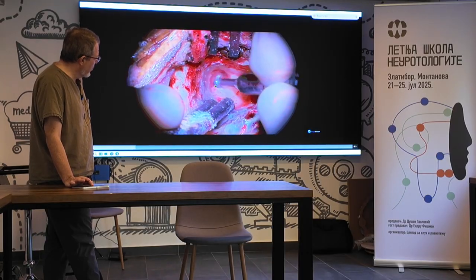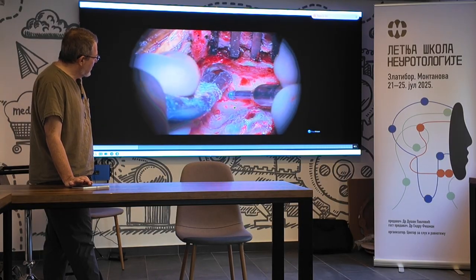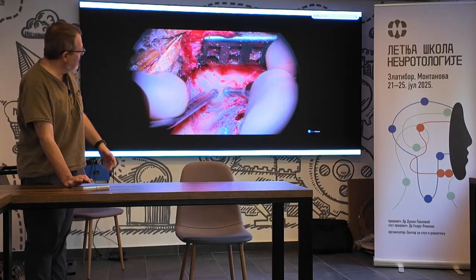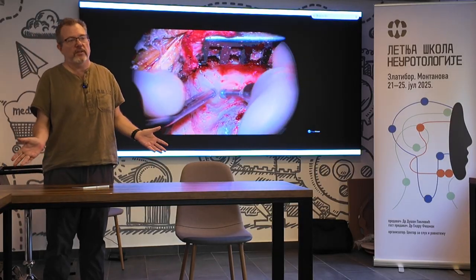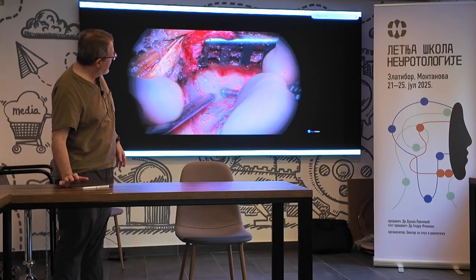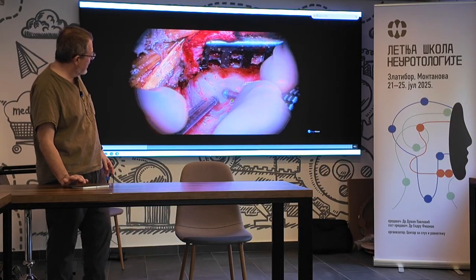And now I'm going to do a labyrinthectomy. So it begins with a labyrinthectomy. And then I know the question that I'm often asked is, why do you need to cut the vestibular nerves if a labyrinthectomy should, in principle, reduce the function of the vestibular system? Isn't a labyrinthectomy alone enough? Well, the answer is maybe in many cases, but not always. And I'll explain that after I show this film.